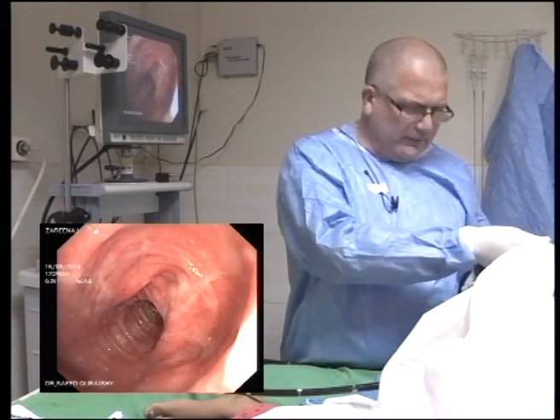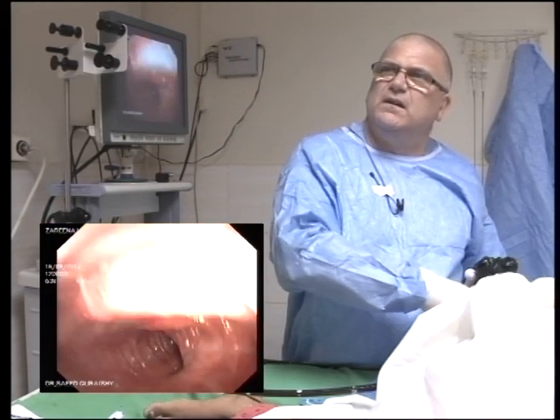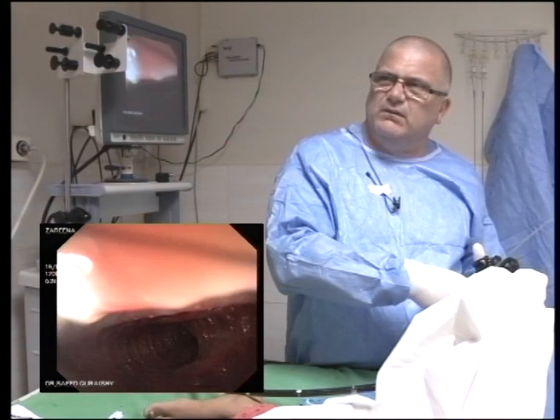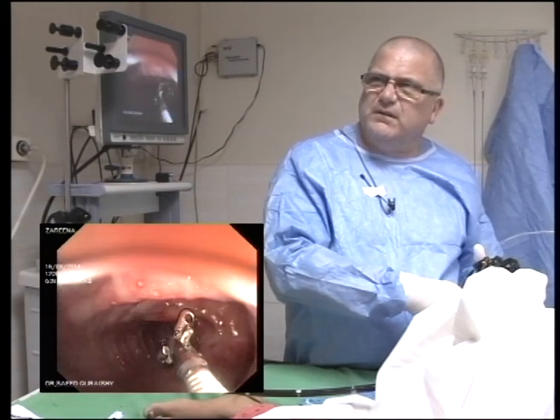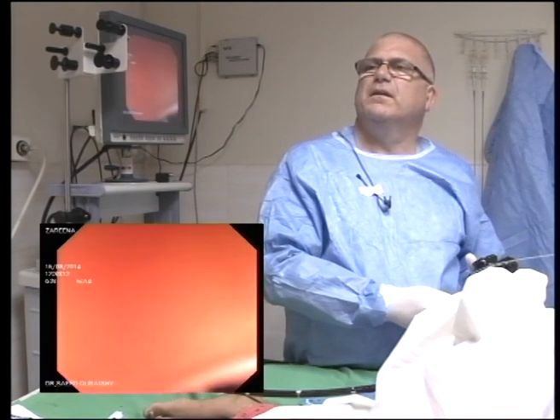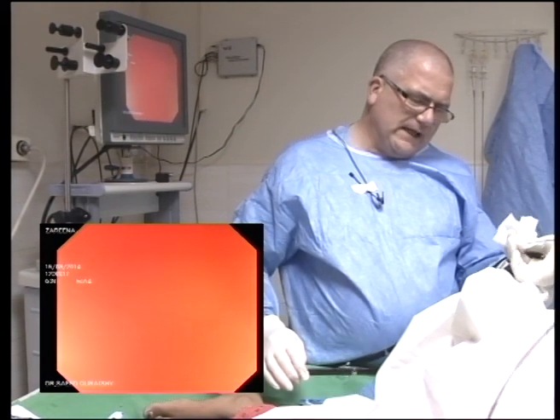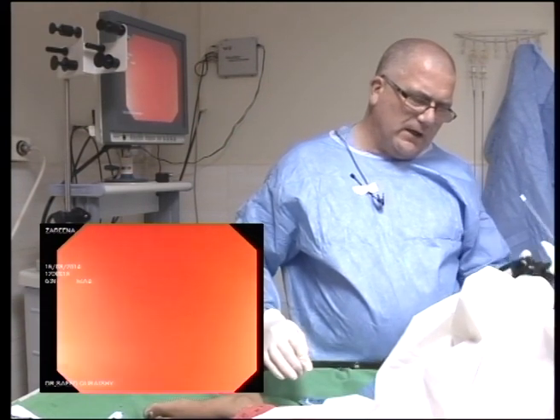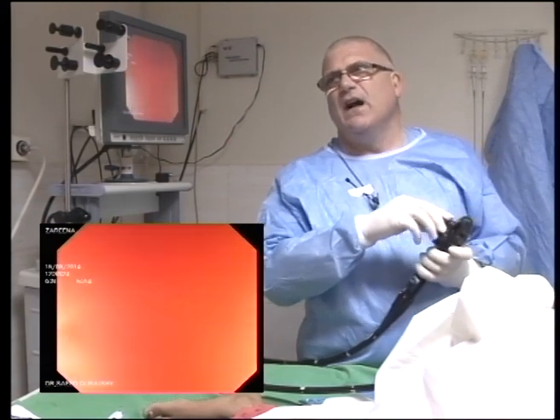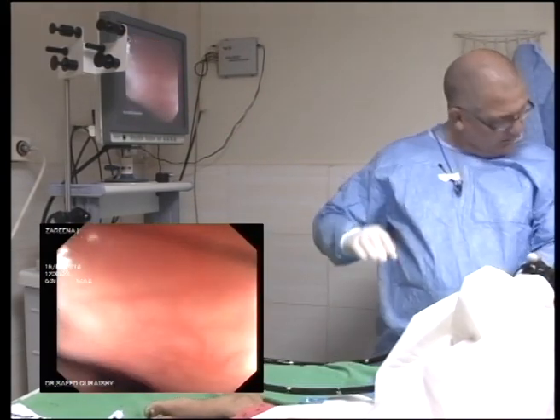I would have preferred to have actually been into the small bowel, but now these are the biopsies that I think are more important. I tend not to take biopsies with a second bite. Some people do. I lose the second one, so I always tend to do single biopsies.